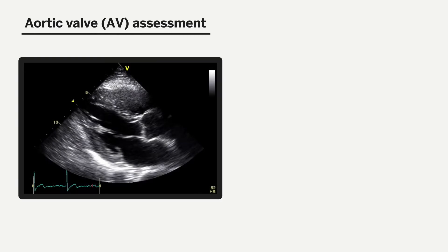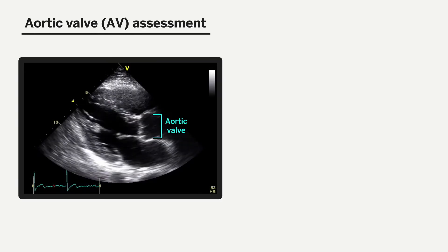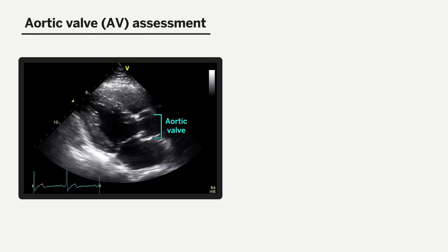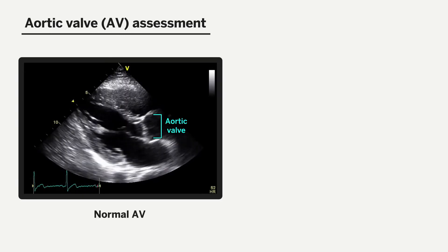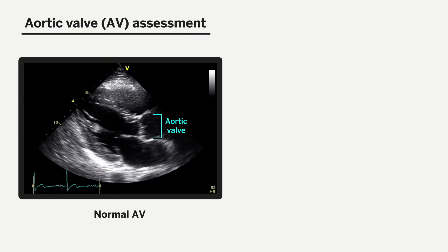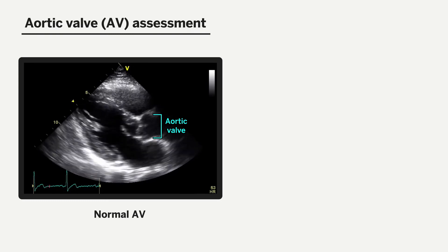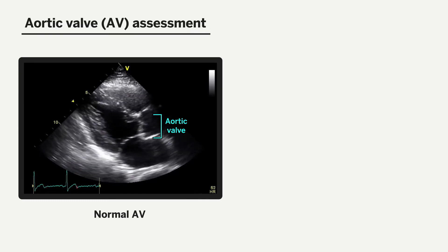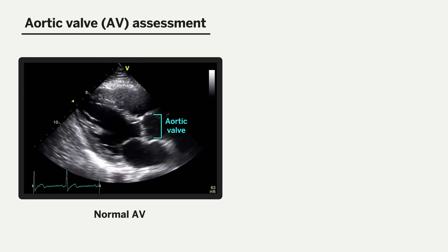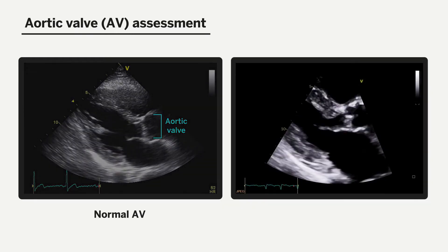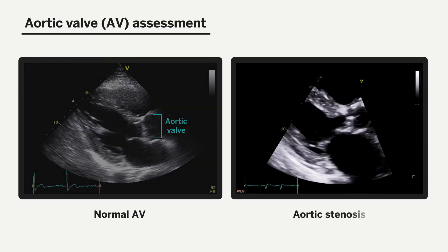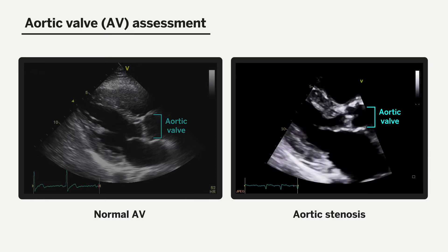The parasternal long axis view is also useful for visually assessing the aortic valve leaflets for sclerosis. Normally, the aortic valve leaflets should appear as thin, pliable leaflets that are freely mobile, as in the video clip on the left. Contrast this to a patient with aortic stenosis, where the leaflets are thick, heavily calcified, and non-mobile, as seen in the video clip on the right.